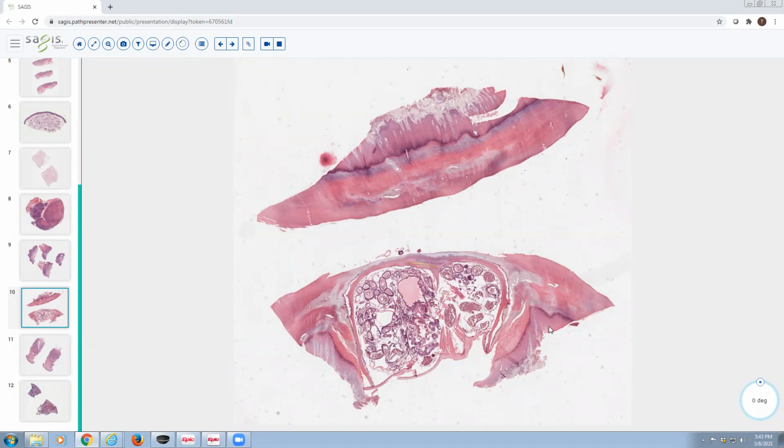And the distinguishing features for Tungiasis really have to do first with the location. So this is really an important observation to make, is where are we anatomically? And for Tungiasis, remember the way that you contract the disease is by stepping on the sand at the beach where the sand flea lives. And so it's usually on the bottom of the foot. And so hence you're going to find that the biopsy site shows an acral profile.